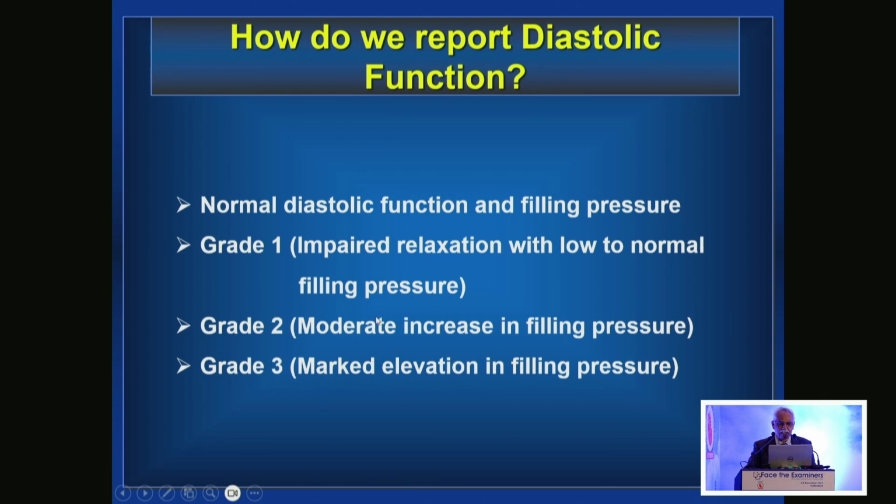So the grade 2 and grade 3 are the patients in whom, if the ejection fraction is normal, they will qualify for heart failure with normal ejection fraction.